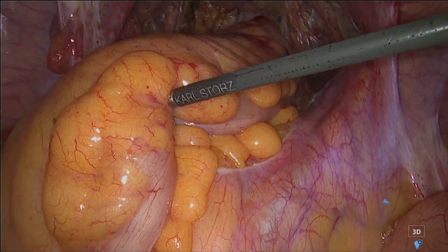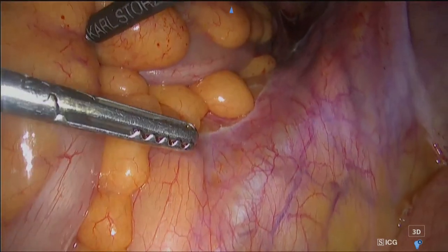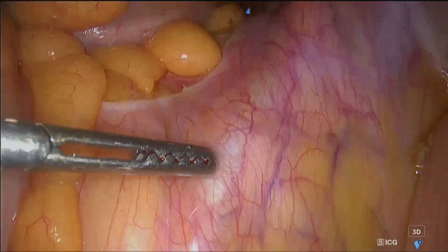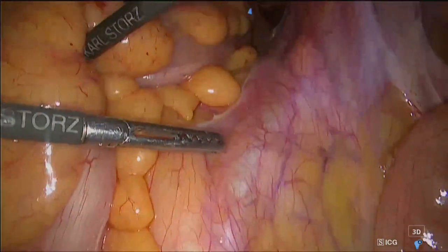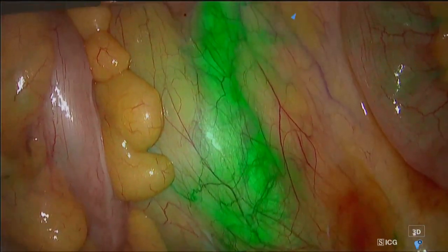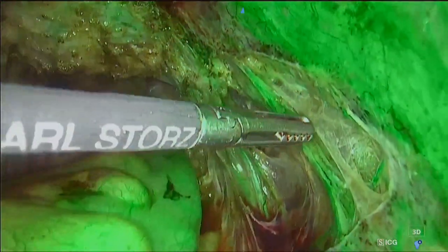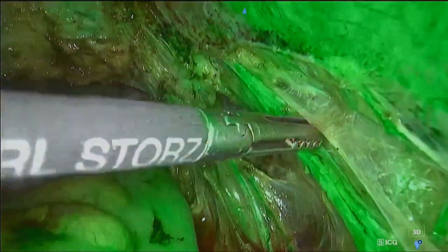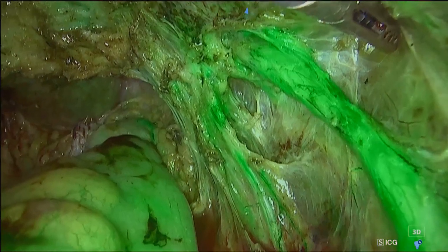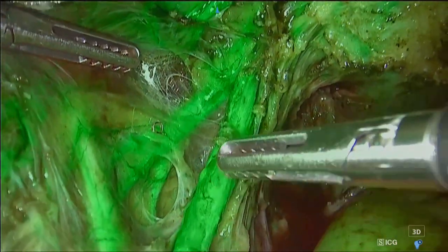Injection intravenous of indocyanine green, pushing on the scope, we change to the indocyanine green vision. We wait very few seconds, and in a few seconds you will see here the indocyanine green arriving from the aorta to the right common iliac artery and then in the pelvis. So on the ureter you see all the vascularization on the right side, preserving the mesoureter and the vessels of the adventitia, the same on the left. You see the uterine artery very well at the origin.